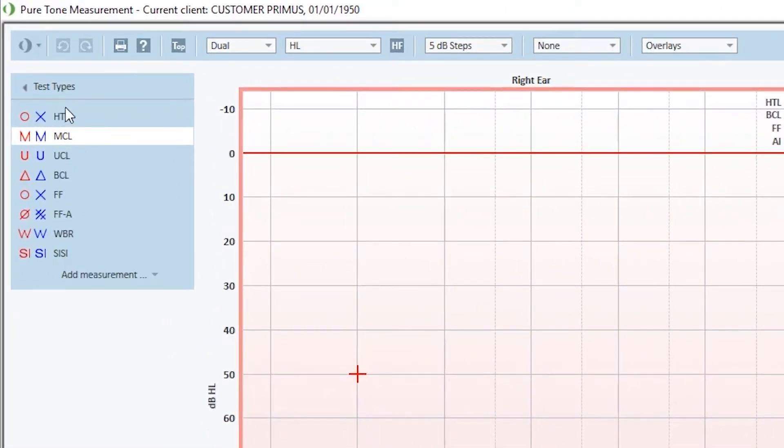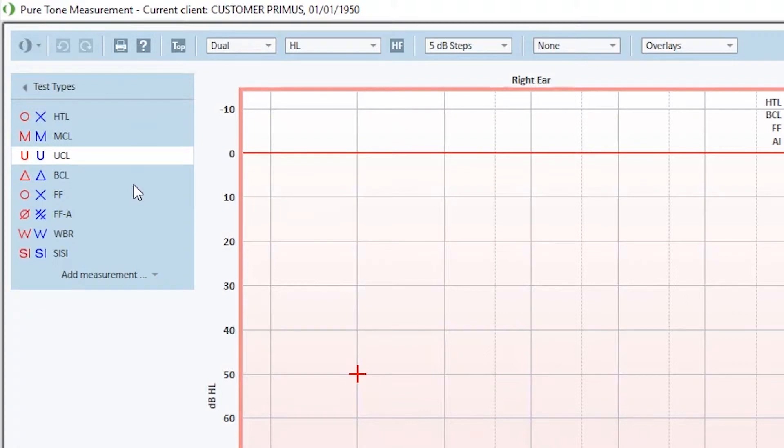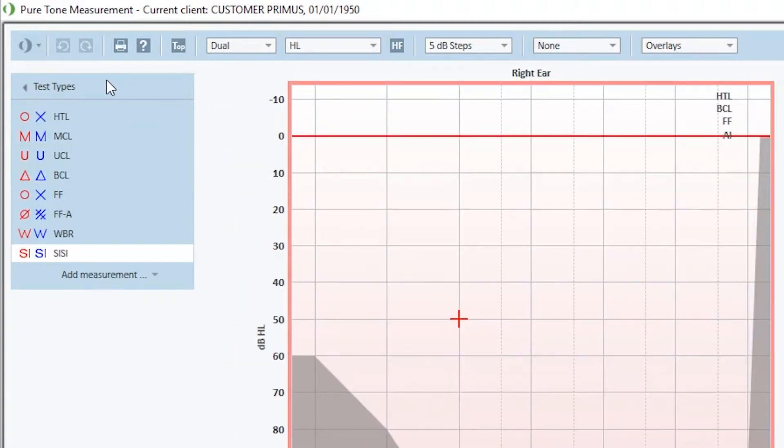The Test Types are selected just by a click. In the top, we have the Hearing Threshold Level, Most Comfortable Level, Uncomfortable Level, Bone Conduction Level, as well as several others.